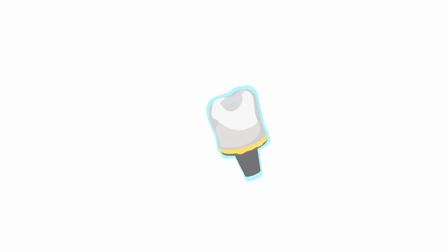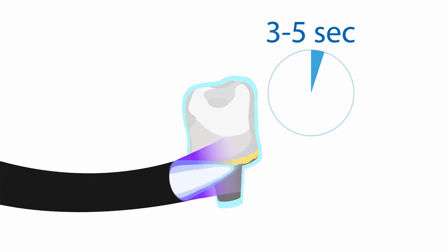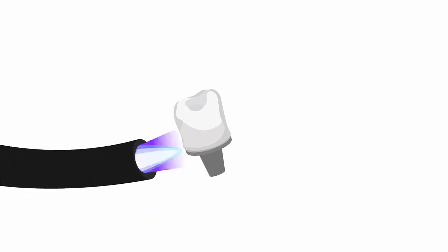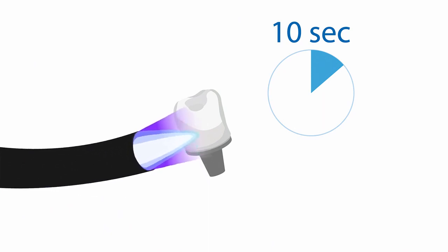Thanks to the optimized cement consistency, you can position your prosthetic exactly. Light cure for 3-5 seconds for an easy removal of excess cement — the excess cement is cleaned up in seconds. As a final step, directly light cure the Panavia V5 paste to create a durable seal.